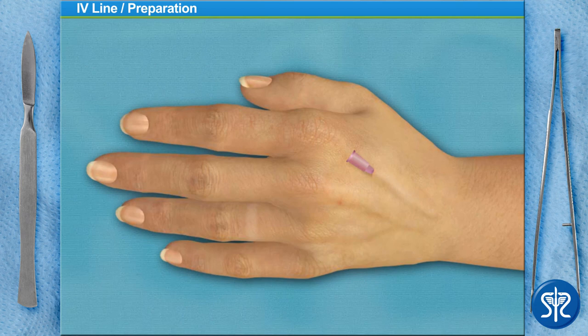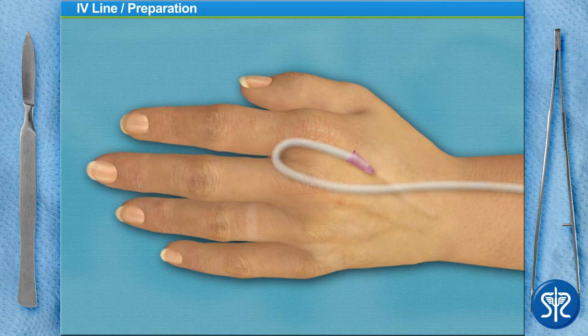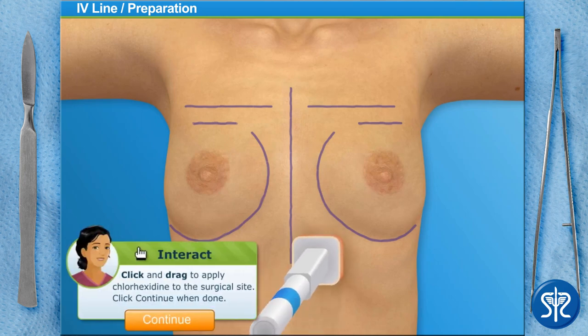I'll lock the IV tubing to the angiocatheter by rotating the locking mechanism. Lastly, we need to secure the IV with tape and test the line. Next, we'll use a chemical antiseptic known as chlorhexidine to cleanse the patient's skin. Use the applicator to apply the chlorhexidine to the surgical site.